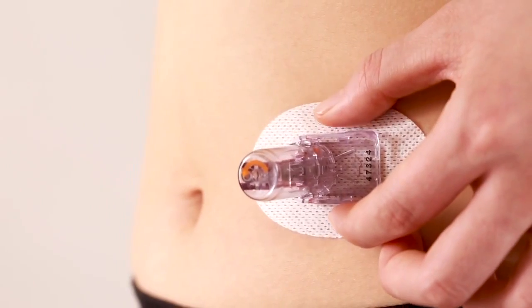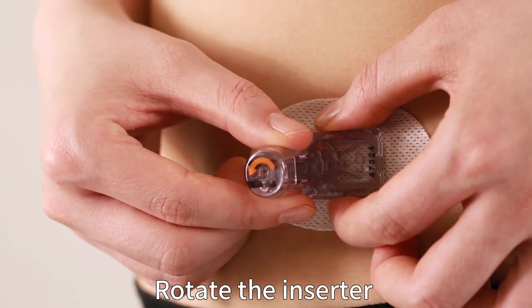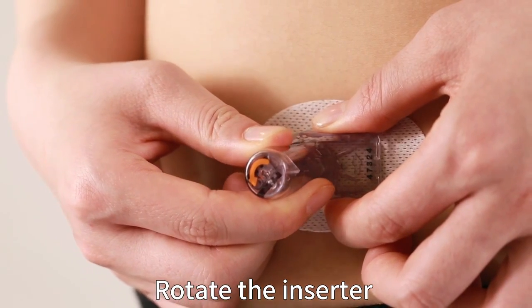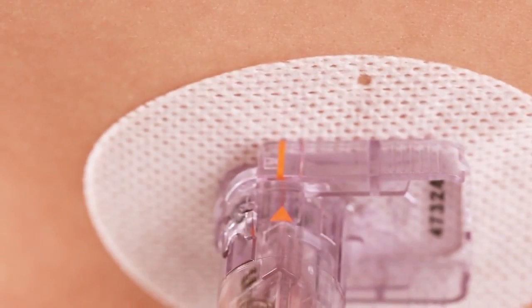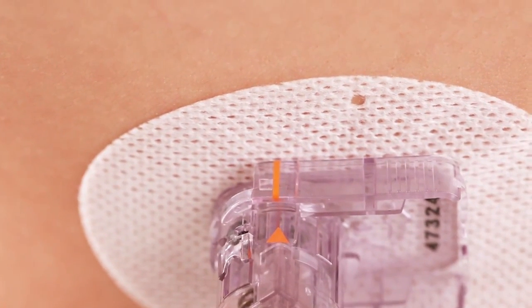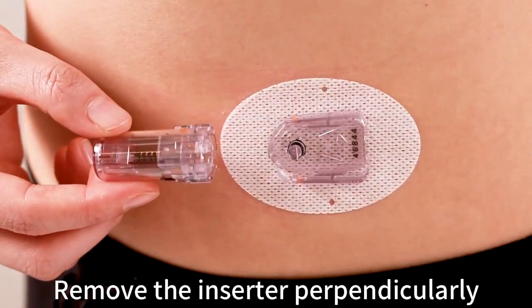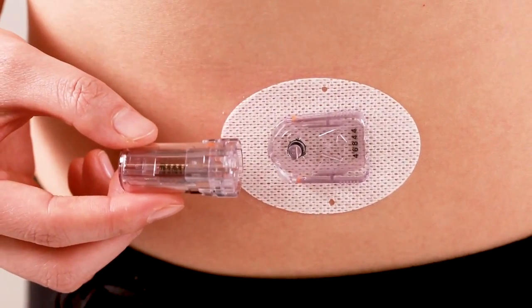Pinch and hold the two ribbed release tabs on both sides of the sensor support mount with one hand. Gently rotate the inserter about 40 degrees counterclockwise with the other hand. The orange triangle mark on the inserter should line up with the orange line on the sensor support mount. Remove the inserter perpendicularly — only the sensor support mount will be left on your body.